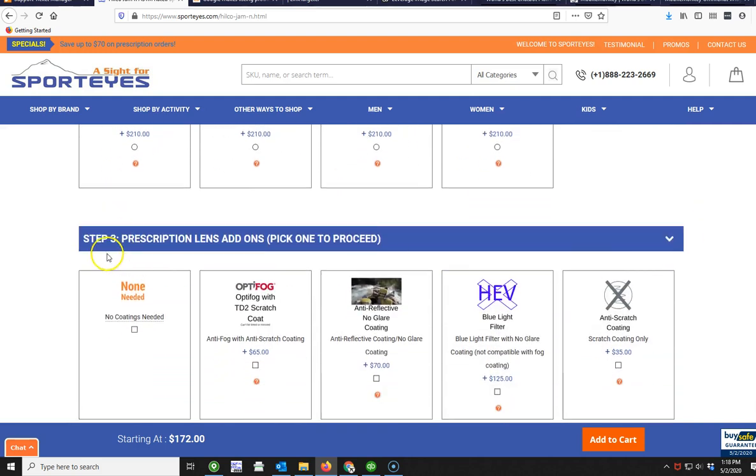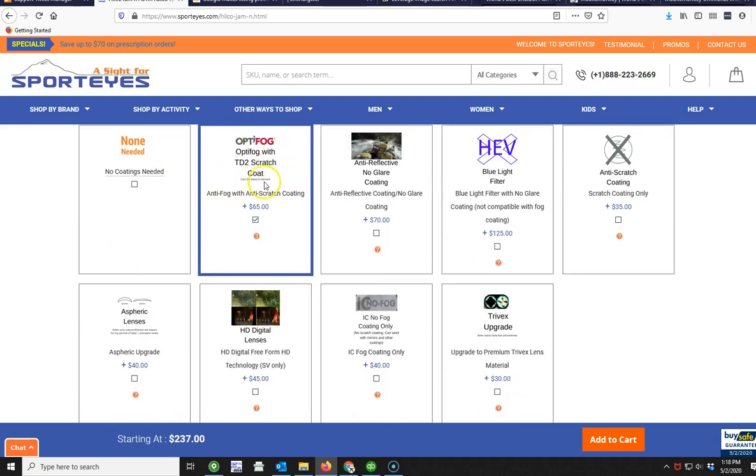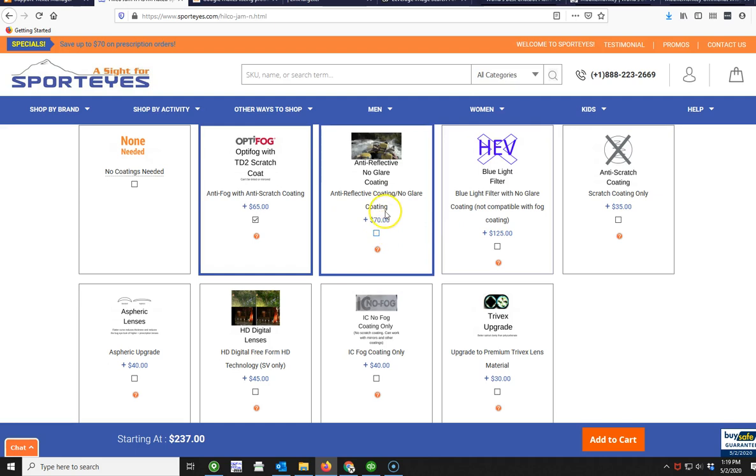This next section is optional: prescription lens add-ons. This is where you can add things like fog coatings, which is probably the most popular thing we do. We've got two brands: the Optifog, which includes a scratch coating and a two-year warranty on the scratch coating, or the basic fog coating only, which doesn't include the scratch coating. Note that the basic fog coating doesn't work with any other coatings other than anti-reflective, so if you want a mirror finish for instance, you'd have to go with the Optifog. Same thing if you want lined bifocals — the basic fog coating isn't made for lined bifocals, so you'd need to use the Optifog.